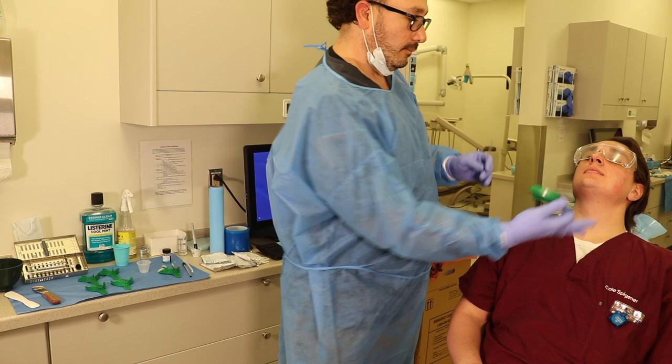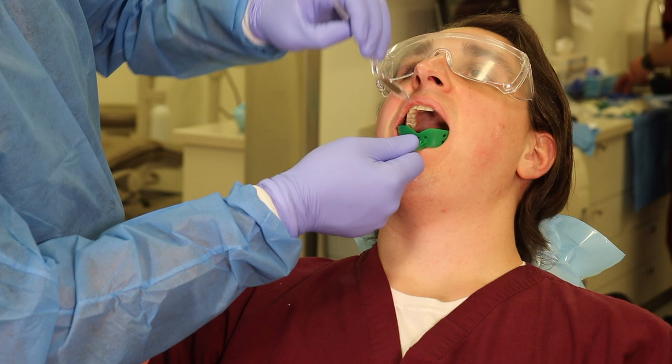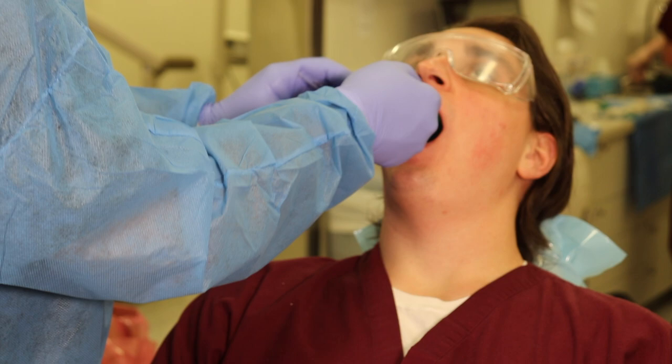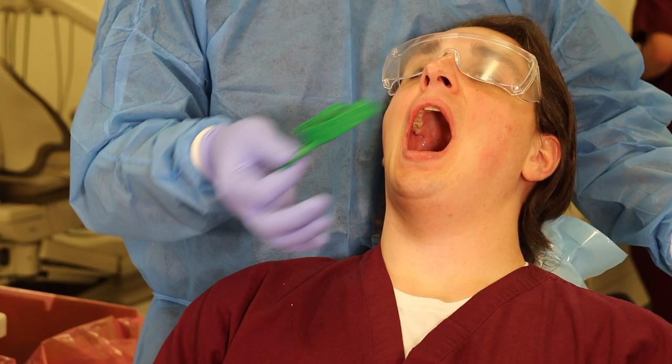On the upper, again, I retract. I want to go all the way to the back to where the hamular notches are, okay? And then from there, make sure it covers all the teeth. This one is a very good size for our patient, okay? Make sure it wobbles and it's easy to take.